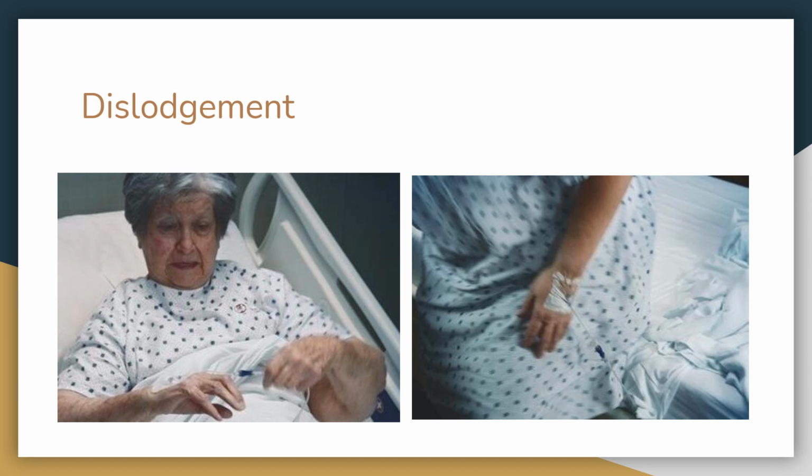So here we have two pictures. On the left is a dislodgement from a confused patient, and on the right is one that just got caught up in the bed sheets.